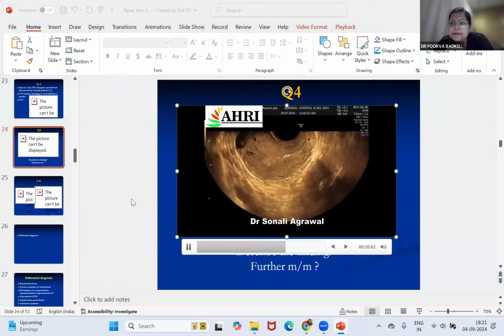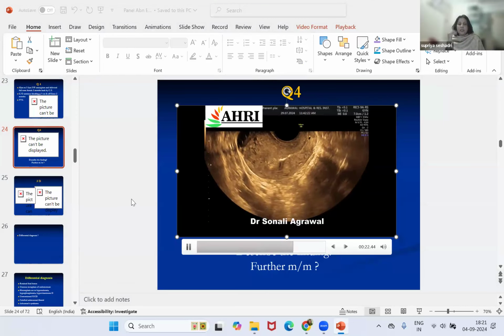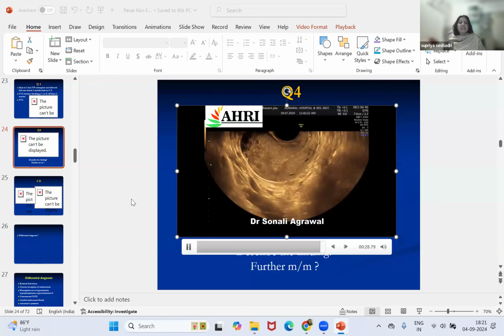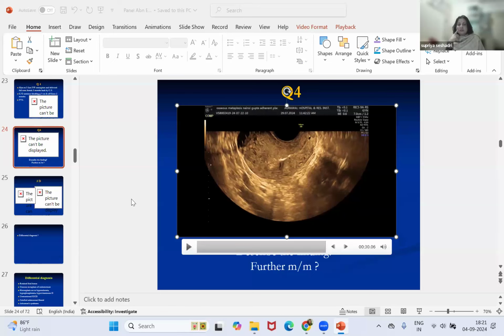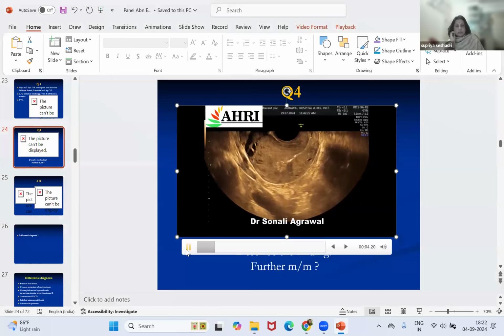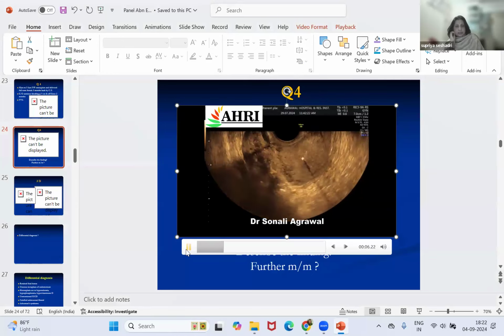I still said that the hyperechoic area there is showing shadowing. Normally, any hyperechoic area showing shadowing is either very intense fibrosis or a calcification. So I would describe this endometrium, and I'll measure the thickness: from what I can make out from the clip, the endometrium appears heterogeneous in the upper part, with hyperechoic areas showing shadowing seen in the lower part. Again, I would think of Asherman's.